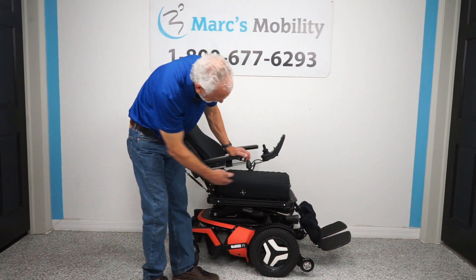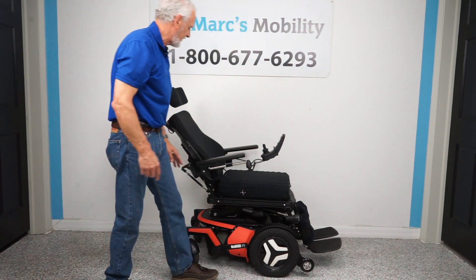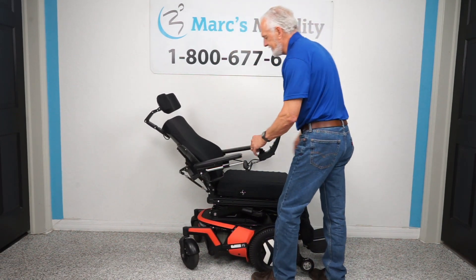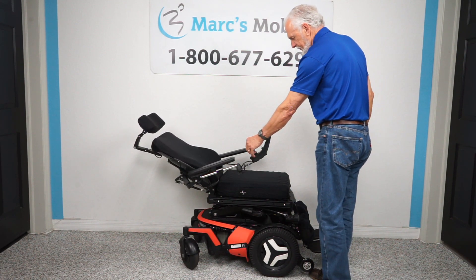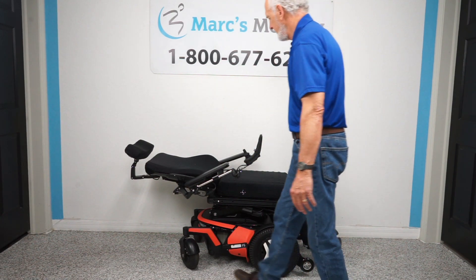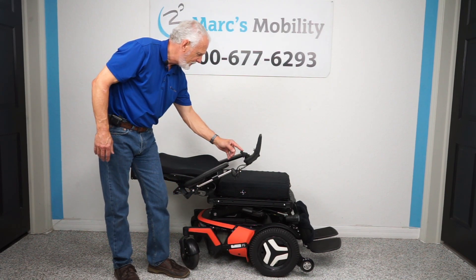Now I'm going to put the seat level and bring the legs back down. The last feature is the electric recline — this is when the back goes back by itself. Nothing else is moving on the chair, just the back going down. The back goes all the way down so you're pretty much flat, and you can have your legs up as well — you can be laying completely flat in the chair.